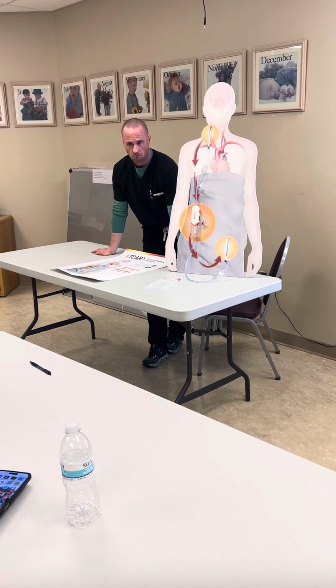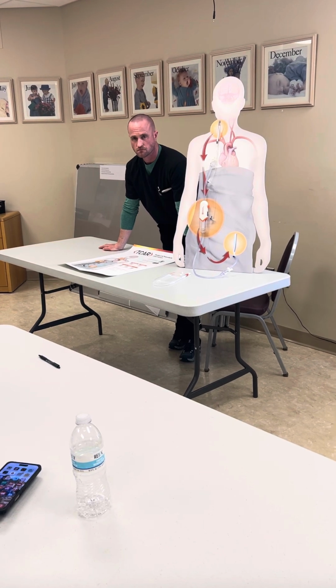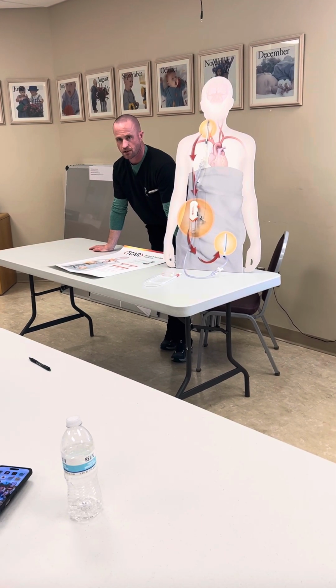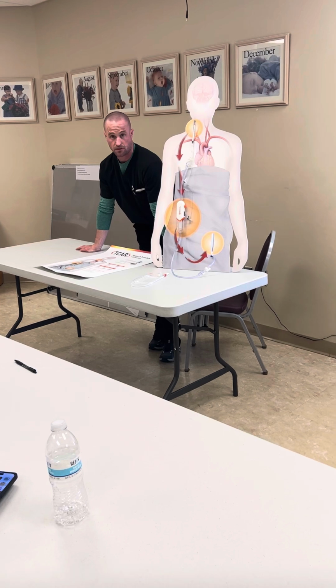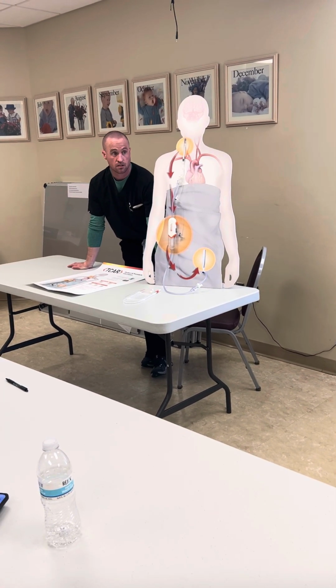So it sounds like we'll need to move the bed a little bit into the center. Okay. I don't know, what rooms are we going to be working in, do you know? It just depends. Okay. And we're here for every case.